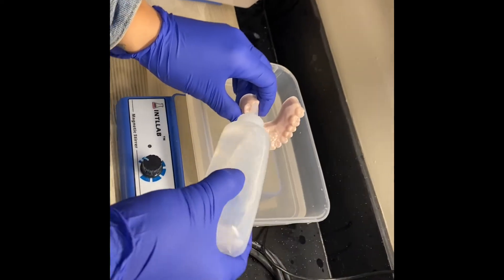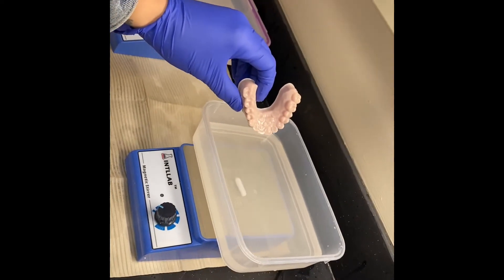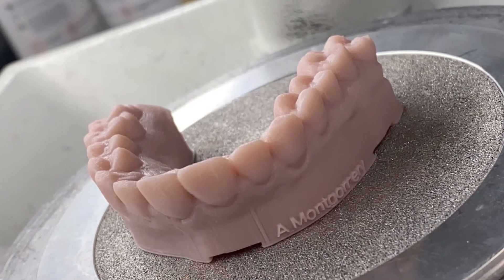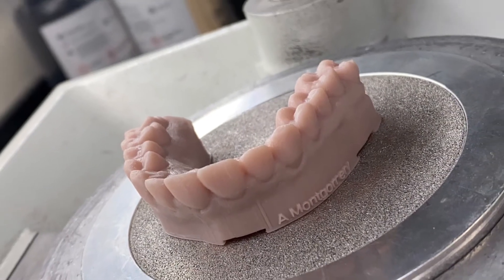Again, we rinse the model to ensure it is clean. The complete 3D model — we are now ready to make our retainer.